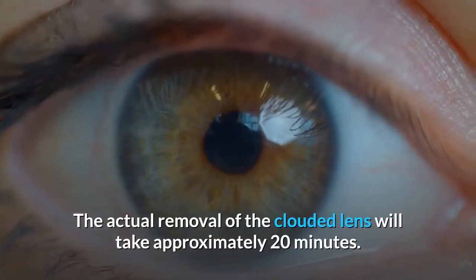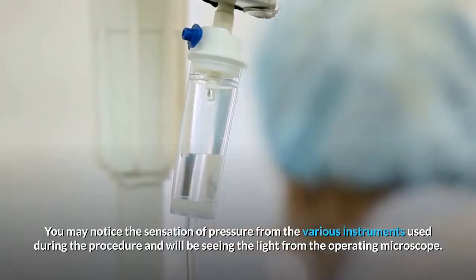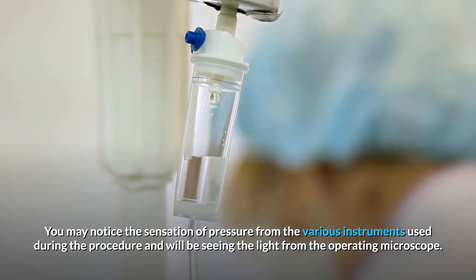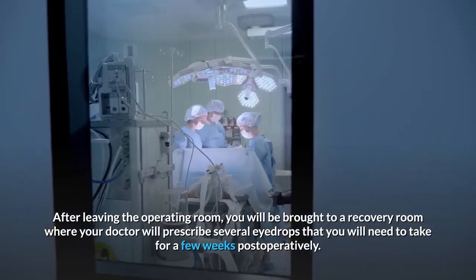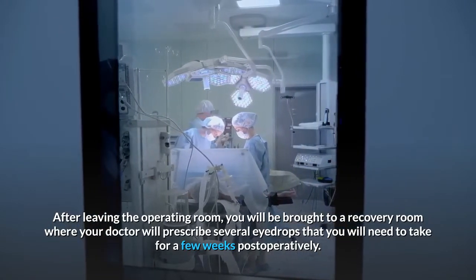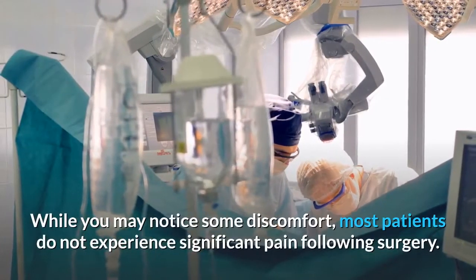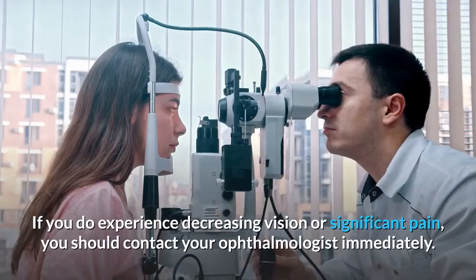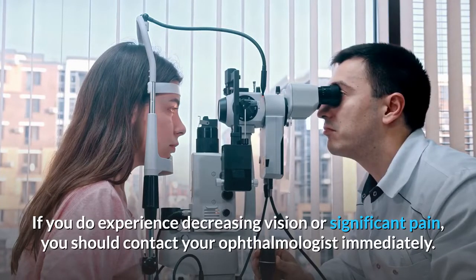The actual removal of the clouded lens will take approximately 20 minutes. You may notice the sensation of pressure from the various instruments used during the procedure and will be seeing the light from the operating microscope. After leaving the operating room, you will be brought to a recovery room where your doctor will prescribe several eye drops that you will need to take for a few weeks postoperatively. While you may notice some discomfort, most patients do not experience significant pain following surgery. If you do experience decreasing vision or significant pain, you should contact your ophthalmologist immediately.